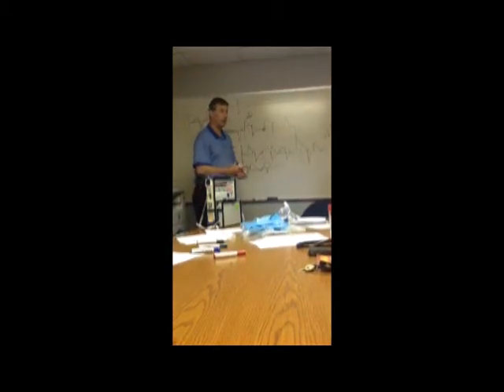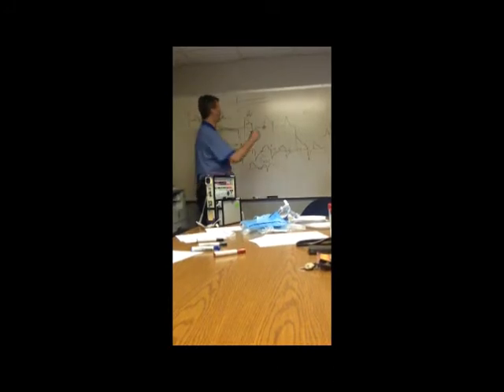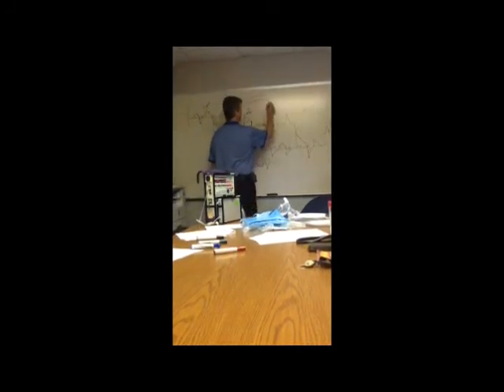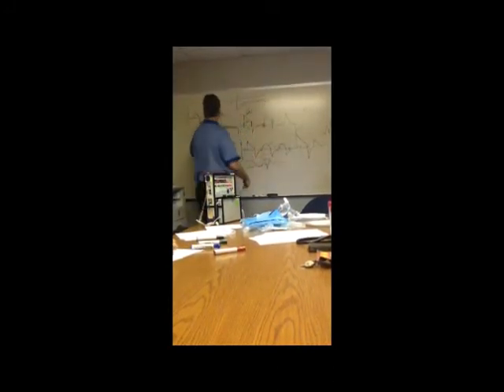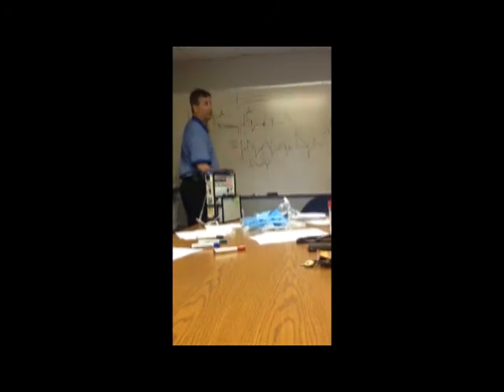So in this case, most of the time, you're going to need to sedate them some so you can work with them. You may want to think about that and use as low a rate as you can get by with, because they need as much exhalation time as possible. But some places will put them in CPAP pressure support, let them determine their own rate. And when they do that, they end up doing all right for a minute, and then they drop their rate to 6 or something so they can exhale, and then they're acidotic.